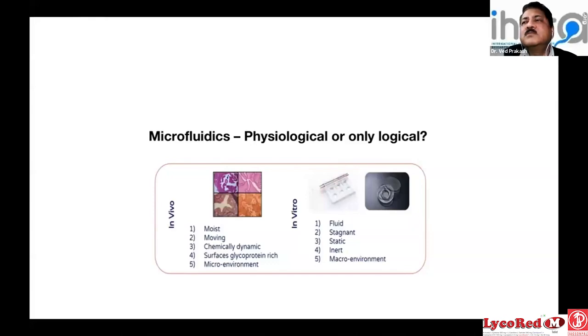So Dr. Ved sir, I had a question as a clinician. Whenever we are opting for microfluidics, at the end of the day we are the face, and we need to counsel them on the cost. The patient does come back to us. You said it could be helpful for increased DFI, so is there a cutoff for which patients would benefit from microfluidics? Is there some cutoff of a DFI that you take, or what are the other parameters?